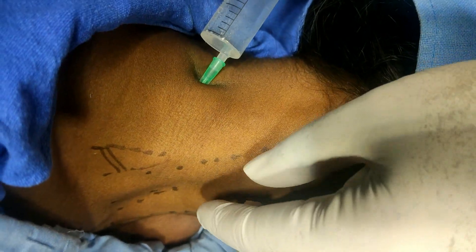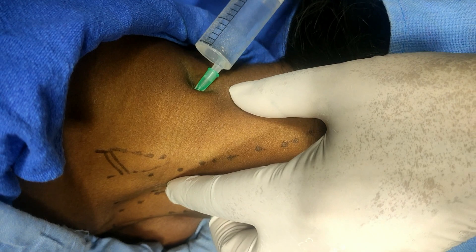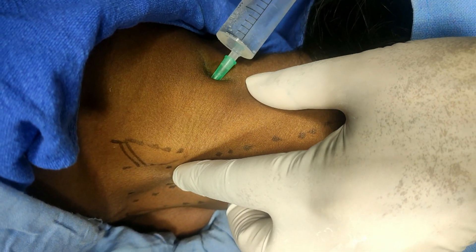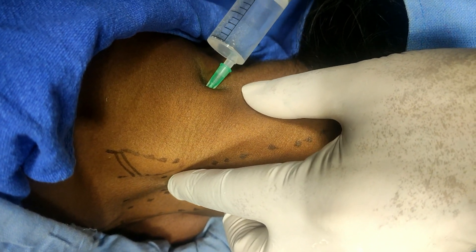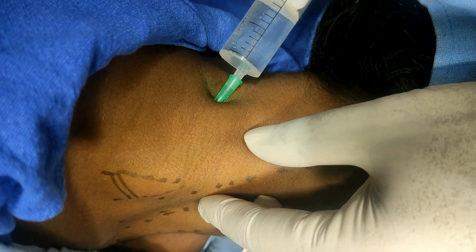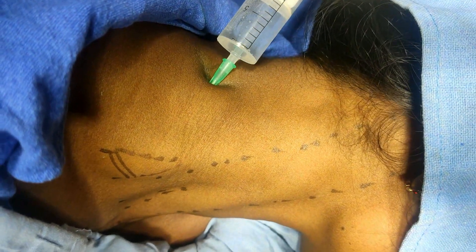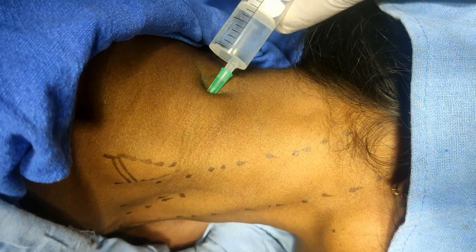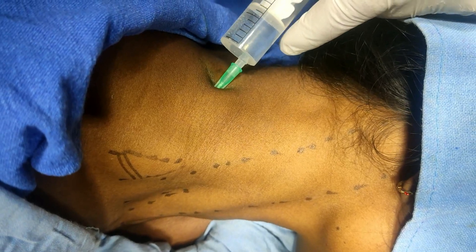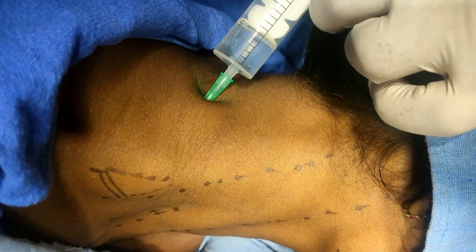Aspirate then inject. You can notice the bulging here. There is puckering because I have taken a one-and-a-half inch needle, but by doing this puckering you can increase the depth of the needle. I am rotating, aspirating, and injecting — rotating, aspirating, and injecting — to avoid accidental intravascular injection. You can notice the bulging here; it means the needle is somewhere near the brachial sheath. Always keep watch on the pulse because the solution also contains a little adrenaline.